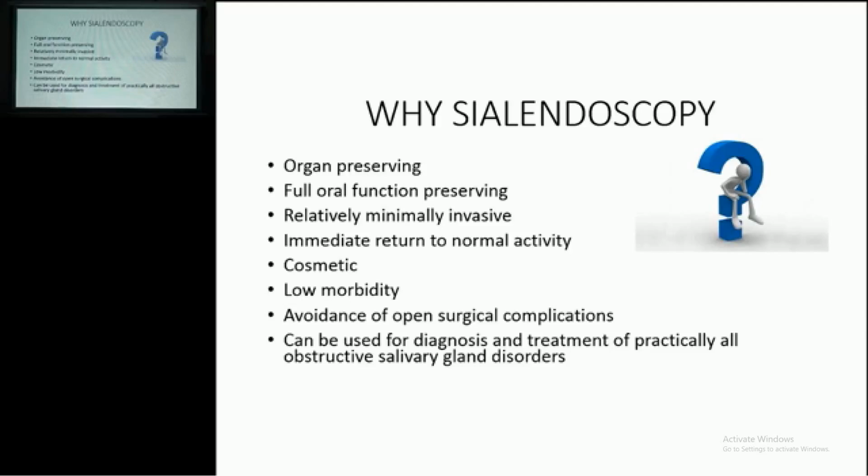It's a relatively minimally invasive technique in the majority of the cases, and hence will have a lower morbidity. You're going through the normal opening, so it is a very cosmetic procedure. And since morbidity is low, there is almost an immediate return to normal activity. Within a couple of days, the patient can go back to work, unlike when you are using an external approach. And of course, if you are using the natural orifices, then you are avoiding all the complications of an open surgical approach.